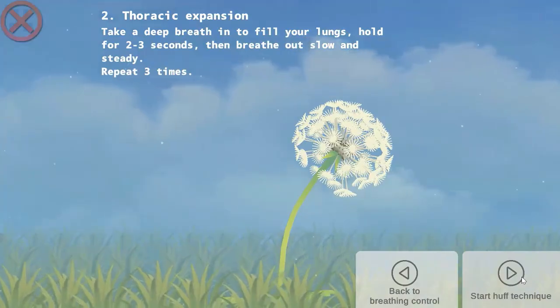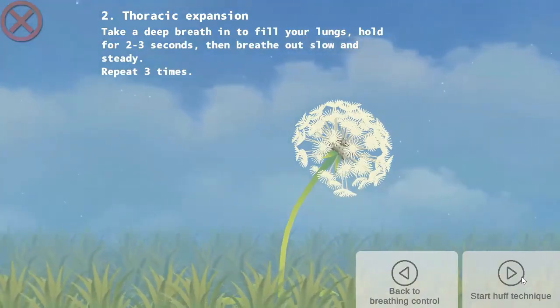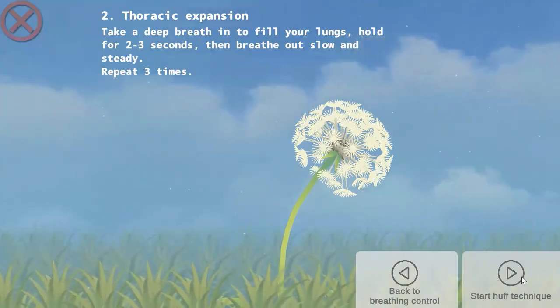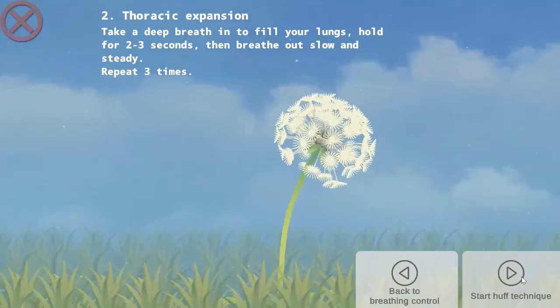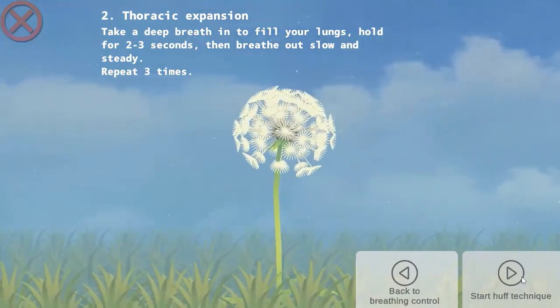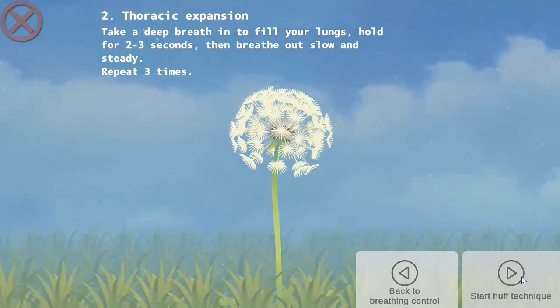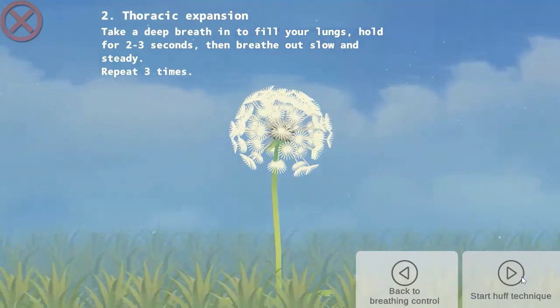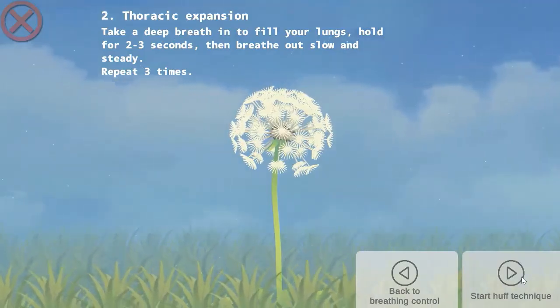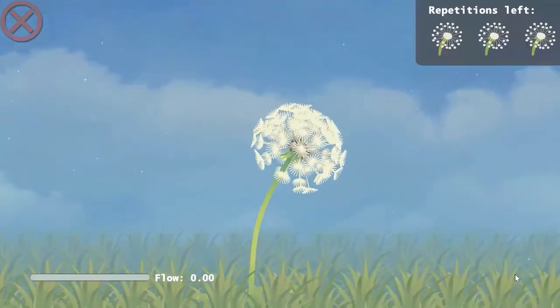Similar look here, but there's more focus on really having the patient have sustained expiration. Now, again, if the patient didn't get good inhalation or expiration, it may look a little different. Right, we don't see the dandelion completely flex, right? It kind of stops midline. And this is what would happen if the patient was not completely releasing that carbon dioxide, not having a good, full, sustained exhalation.